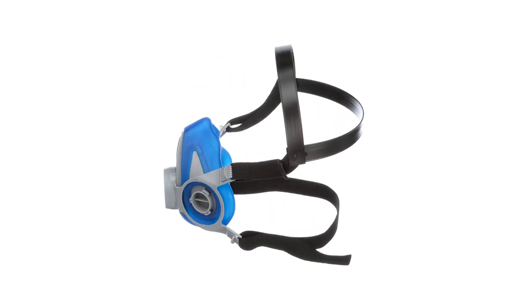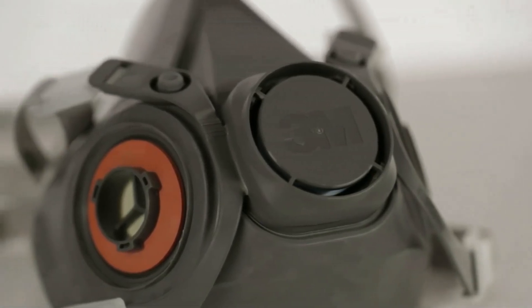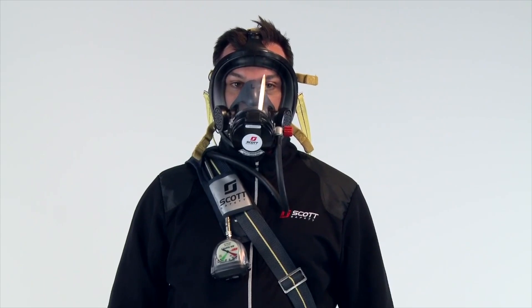The AccuFit 9000 can conduct respirator fit tests on disposable filtering facepiece respirators, half mask and full facepiece respirators, tight-fitting powered air purifying respirators, CBRN respirators, and self-contained breathing apparatus.